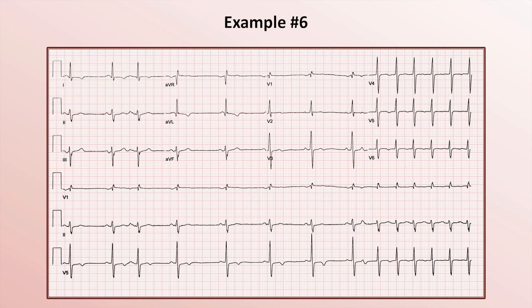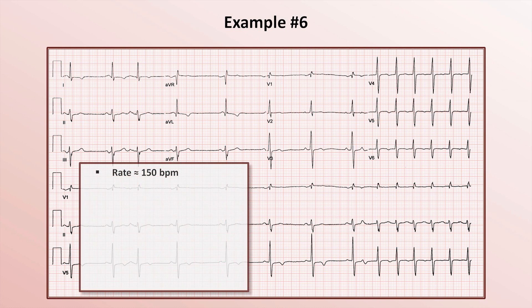Example 6. The tachyarrhythmia begins just in the last quarter of the EKG. The rate is about 150. It is regular and narrow complex.